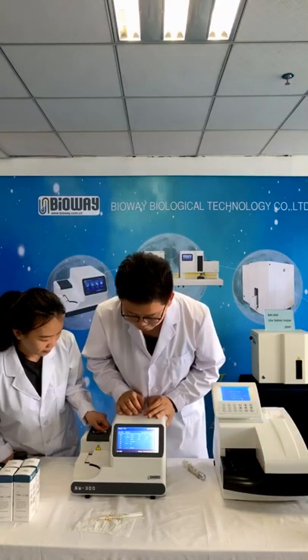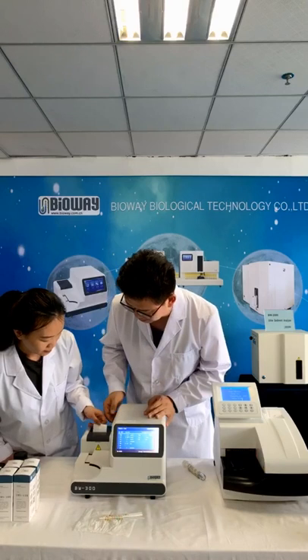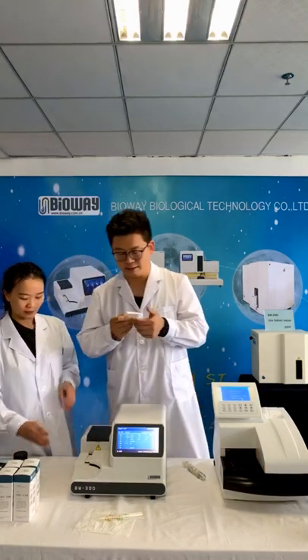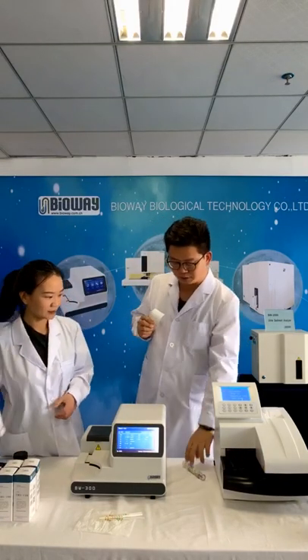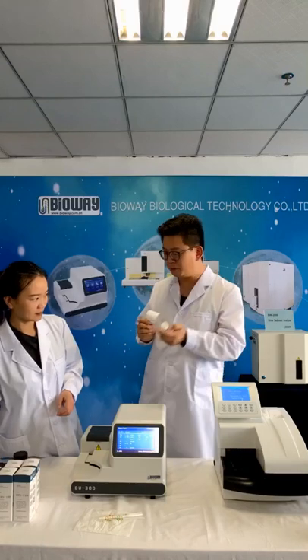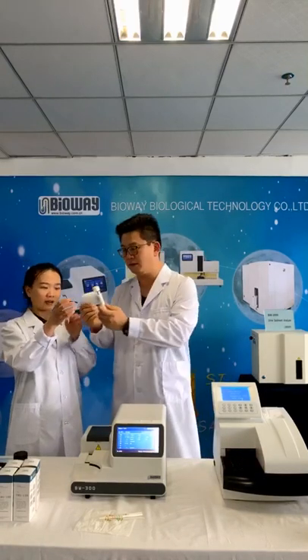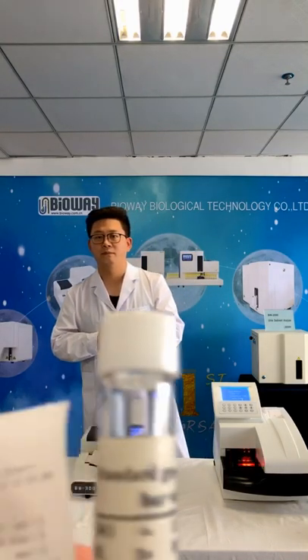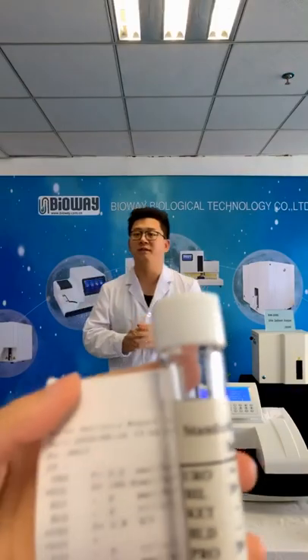Yeah, the result has been displayed, but it's very short, because we said, that is the result for the calibration strip. Would you please make a comparison for the audience? Are they the same? Have a look at that. Yes, this is the same. The same. How are the values?